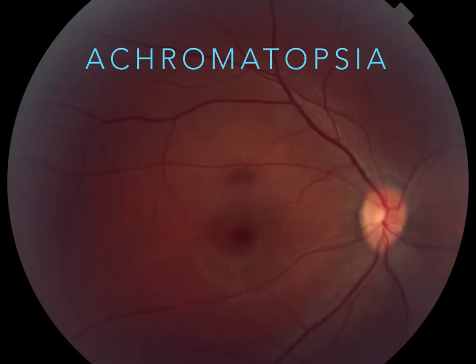You see a dark spot here. She had the same thing in her other eye. Anybody know why she has a dark spot there? It's a bit of a camera artifact. When they're really highly myopic, you can actually get something we call the Allen spot. But it's a camera artifact that's a little bit darker, and it usually tells you where they're fixating. And so she's not fixating in the center for obvious reasons.